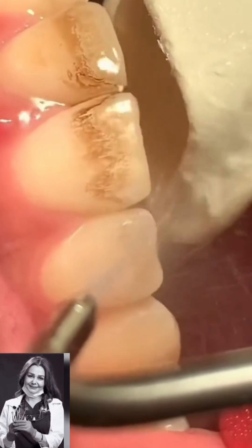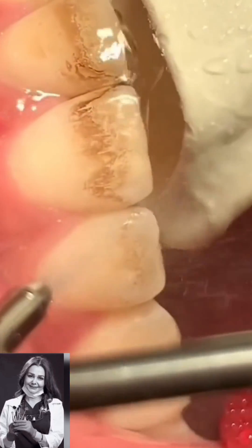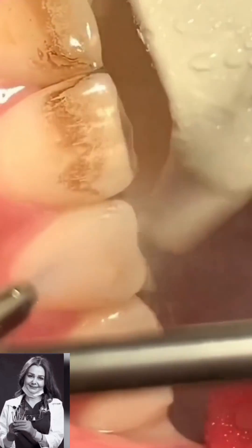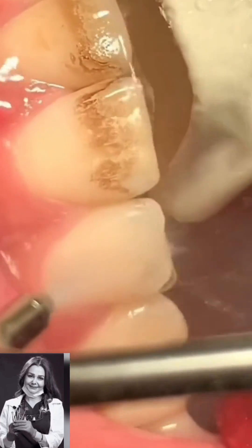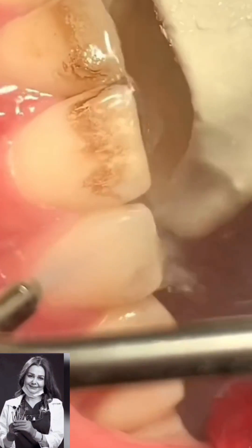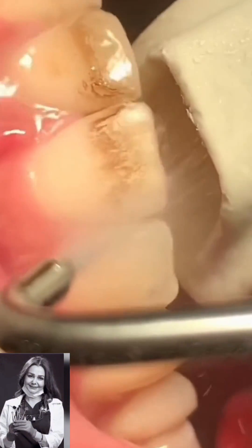Teeth sandblasting is a quick and painless procedure. It is often recommended to patients during routine prophylactic oral inspections.